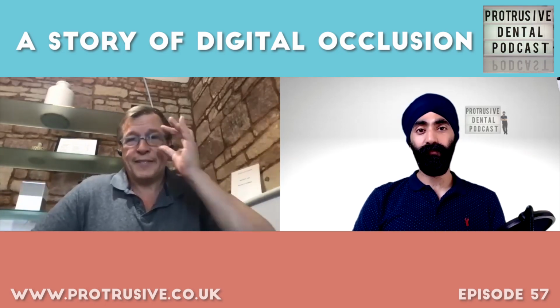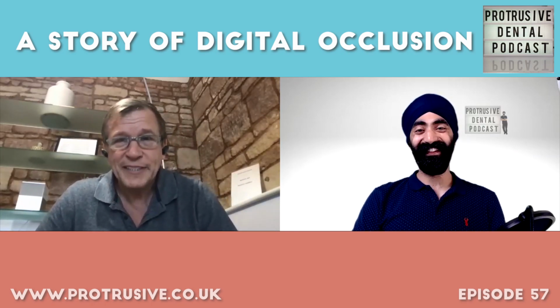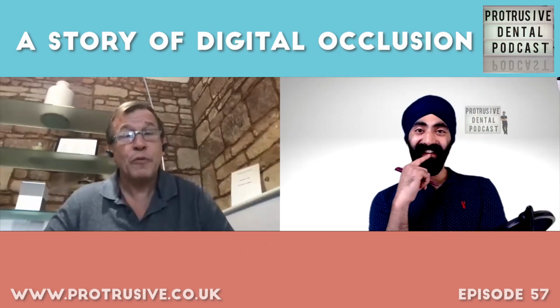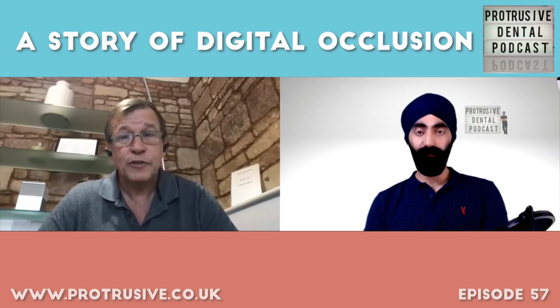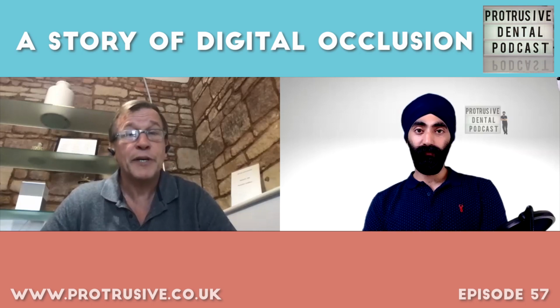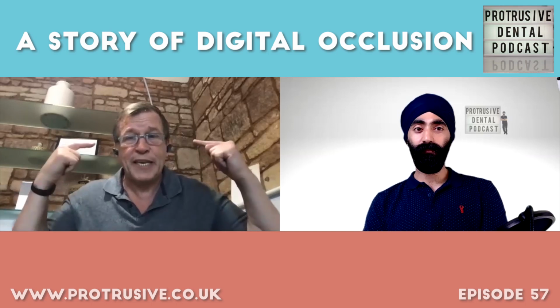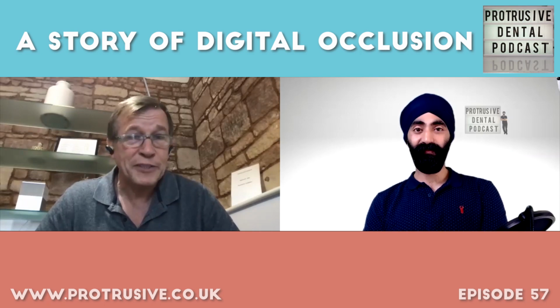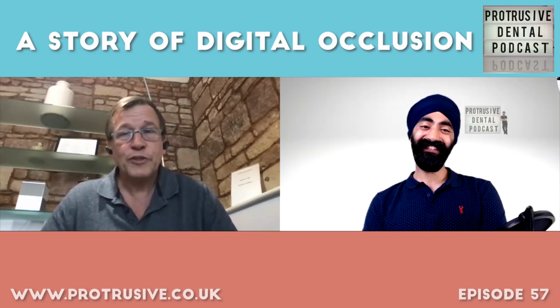So let's blow up a few sacred cows, seeing as it's just me and you. Has to be done. Let's think about that. Well, don't get me wrong. If you're in the analog world, this is still a great way of doing it, because it's going to give you a lot of great information, and I've done it for years, and it works fab. But let's think about it. So we put it in the ears. Well, we're actually looking for the medial pole of the condyle. Well, unless you're pressing real hard, you're not getting there. So what do most face bows do?